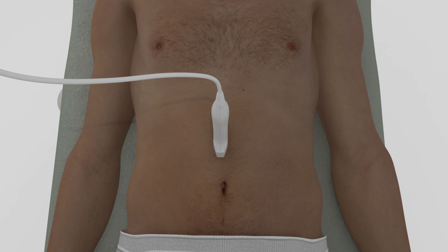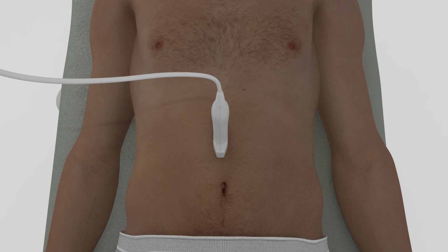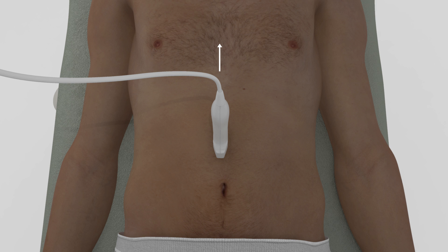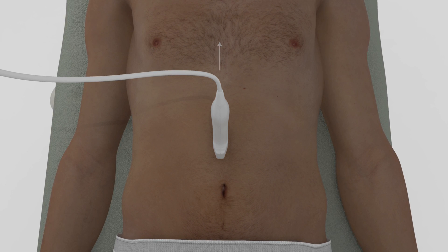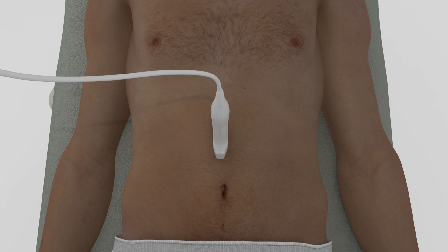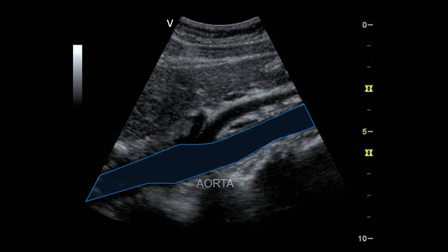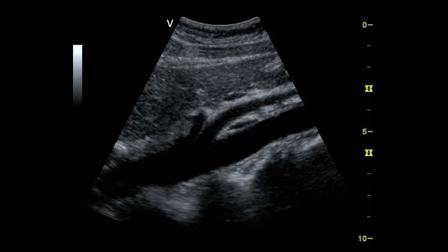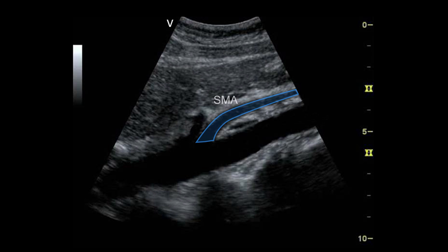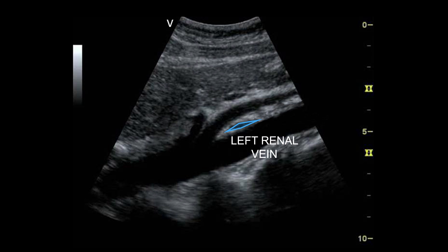Next, view the abdominal aorta in the longitudinal plane. Orient the probe so that the probe marker is pointing cephalad. Begin scanning just below the xiphoid process and continue scanning inferiorly to approximately the level of the umbilicus. In this long axis view of the abdominal aorta, you can see the celiac artery, the superior mesenteric artery, and the left renal vein.